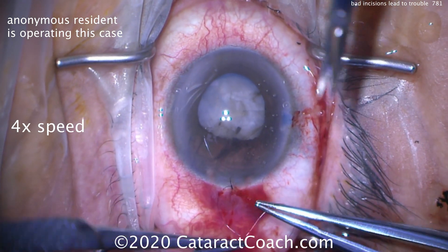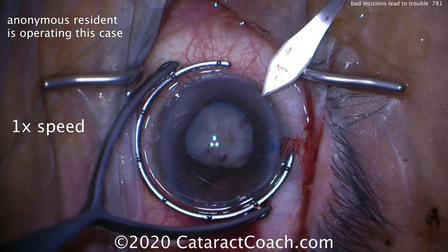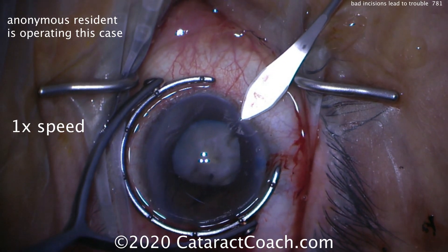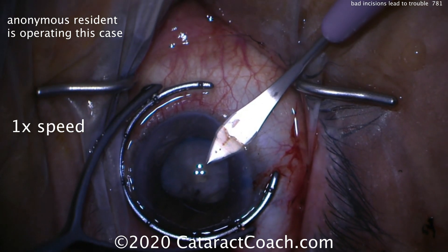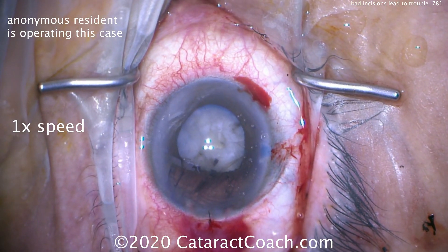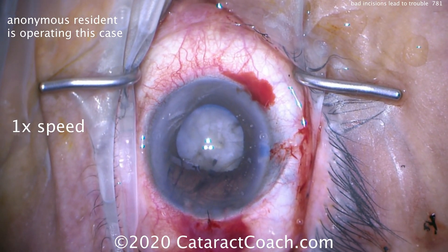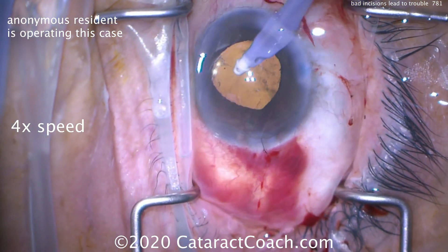You can also tell by the suturing technique here, even sped up, the resident is obviously early in the learning curve. Now moving to the superior position — the surgeon is sitting superiorly, and now a better incision can be made there. This is an important lesson: abandon the first incision. It's too damaged, too leaky — and continue.